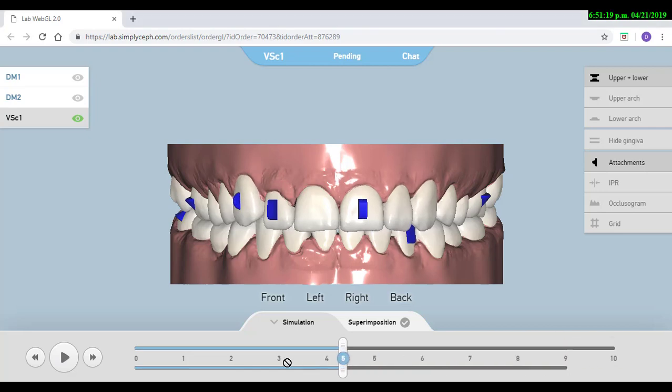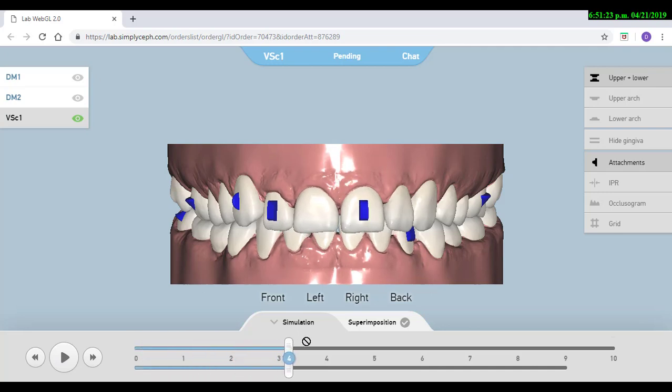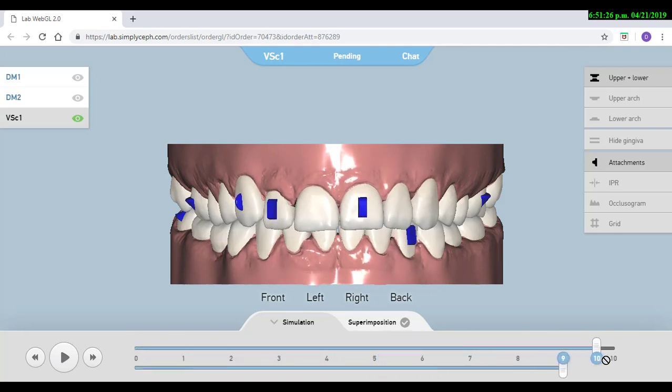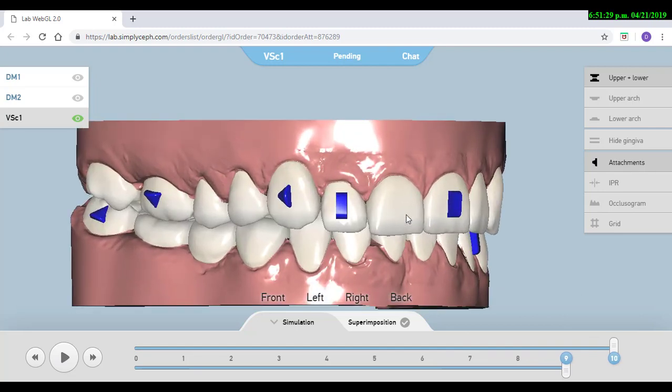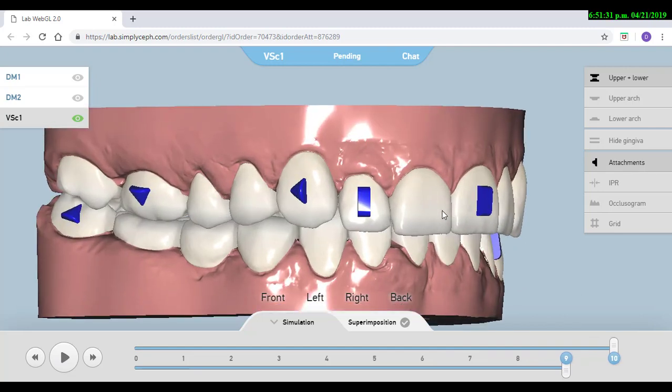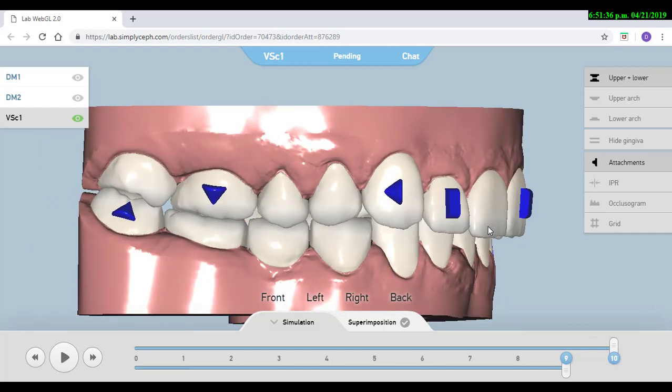For example, in here we have a deep bite and I'm making intrusion of those upper and lower incisors. So if the patient has a gummy smile, this intrusion that we are performing is going to actually help us to reduce that gummy smile.